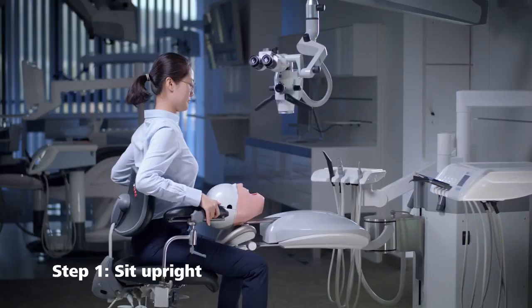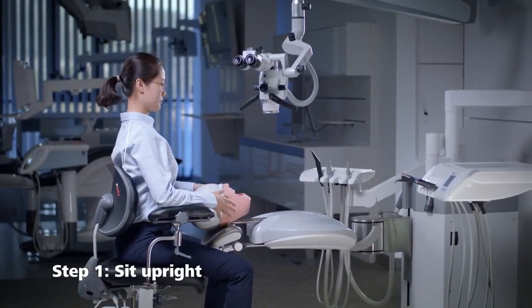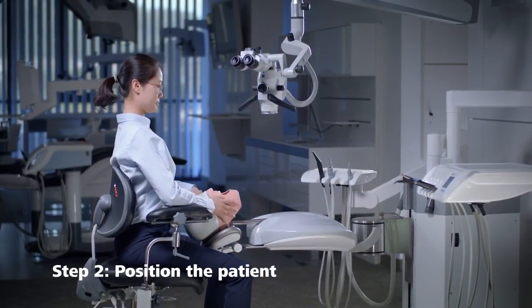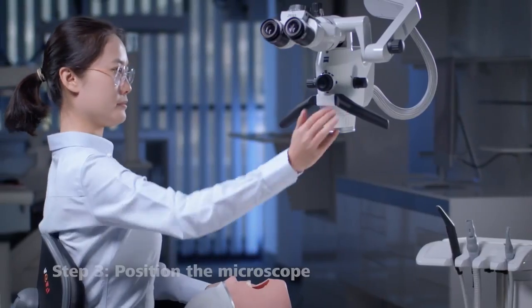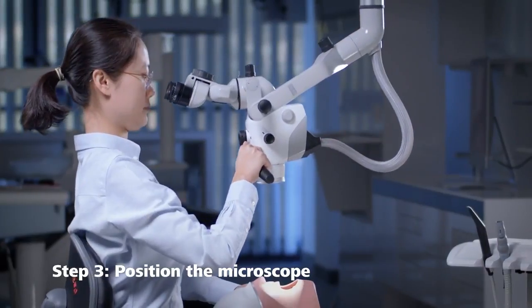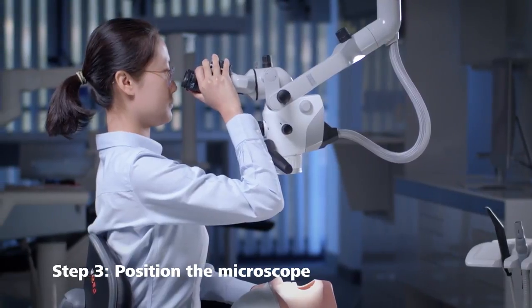First, bring yourself to a neutral body position by sitting upright with a straight back. Position the patient in front of you in a way that allows you to comfortably access the oral cavity. Once the patient is in position, move the microscope in front of you and adjust the angle of the binocular tube without changing your natural body position.